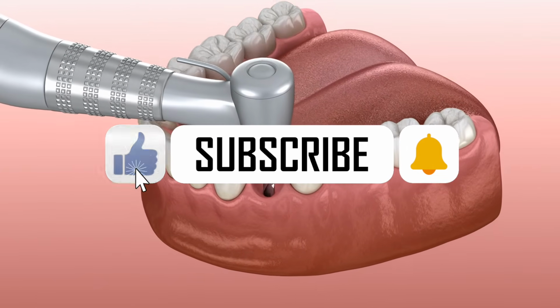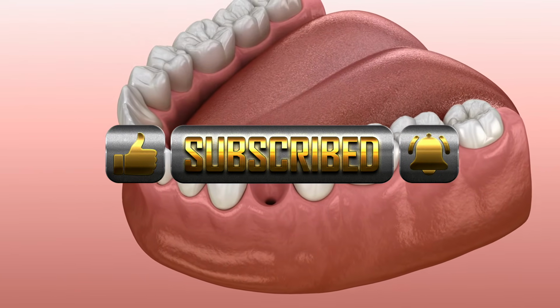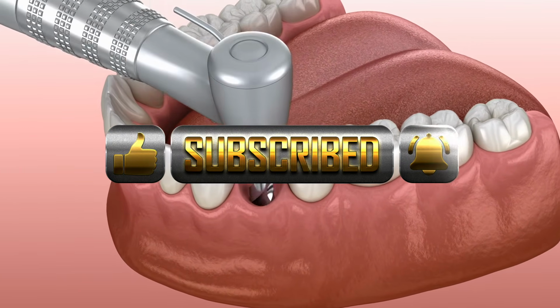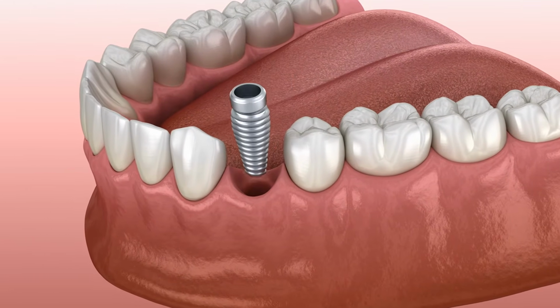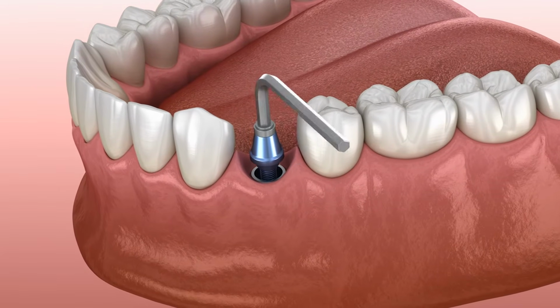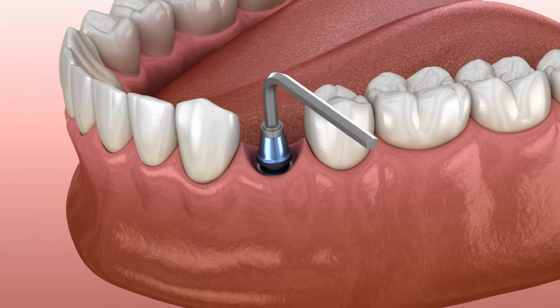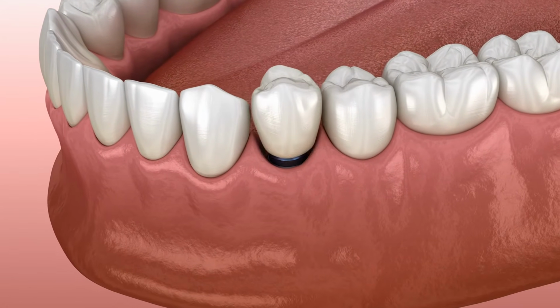Pre-surgical assessment. Before surgery, your dentist or oral surgeon uses advanced 3D imaging, such as a cone beam CT scan, to evaluate bone density, nerve locations, and sinus position. This ensures precise planning and safe placement of the implant. A custom surgical guide is created to mark the exact location for the implant.